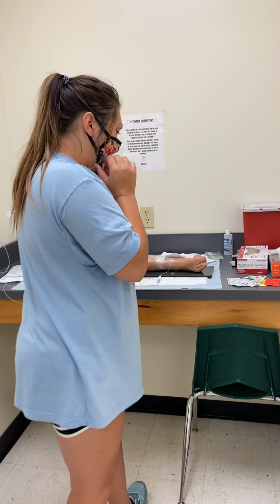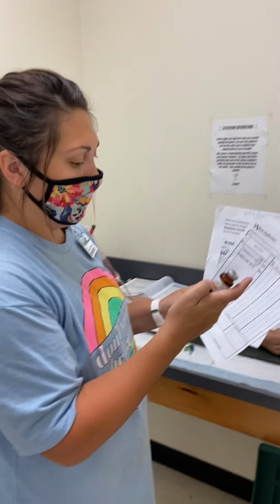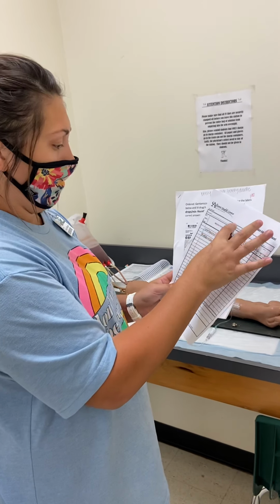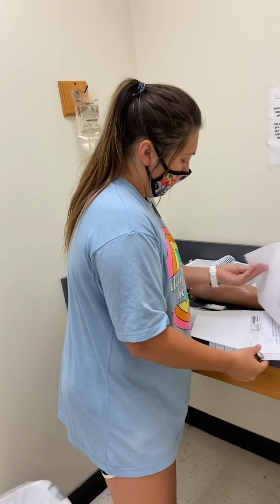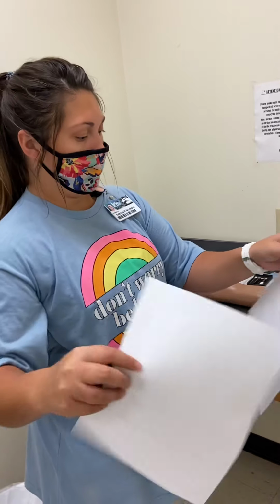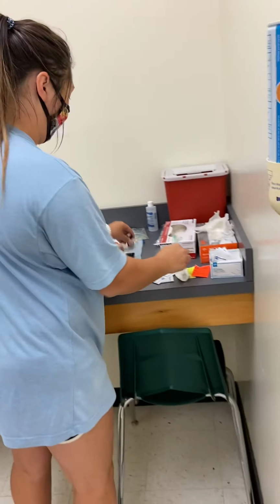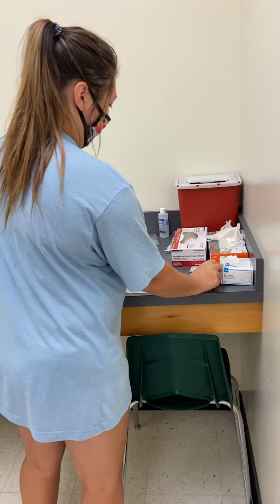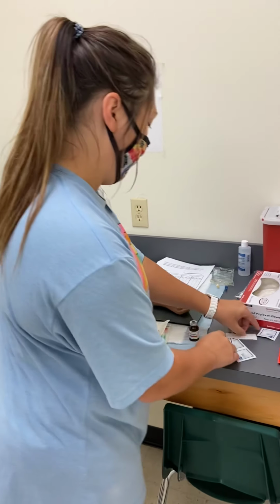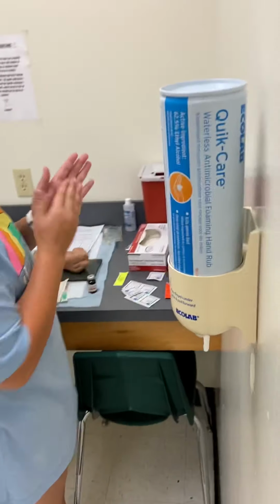So after I did all that, I'm going to gather my supplies, and then I'm going to check my expiration date and check my medicine with my MAR, and it matches up. Furosemide, this is actually 100 milligrams. We're going to be giving 4 milliliters, because I've already previously done my drug problem. So my furosemide, my syringe, my needle, and an alcohol prep, and my label. And I'm gonna wash my hands.